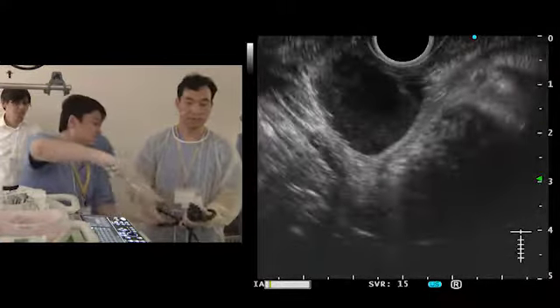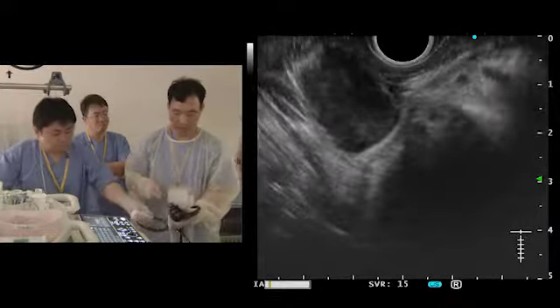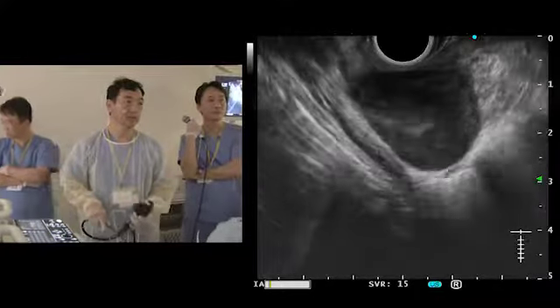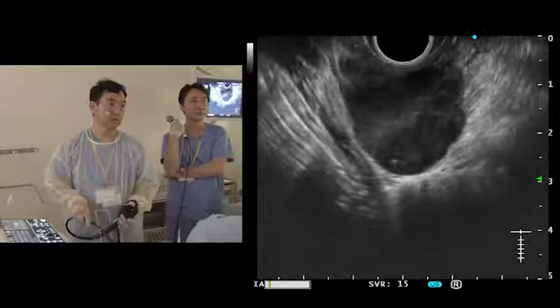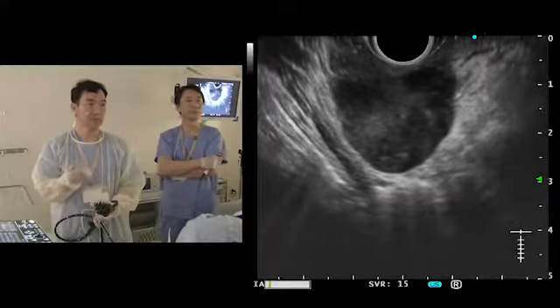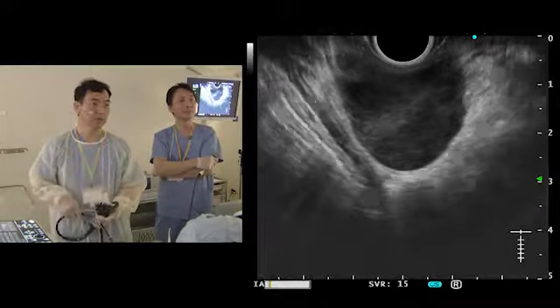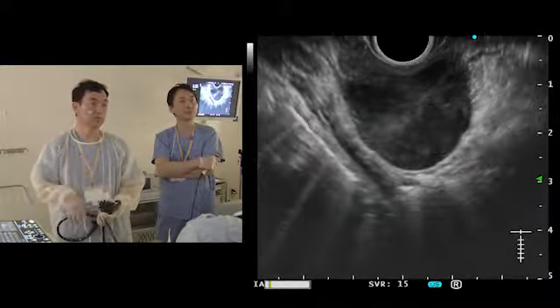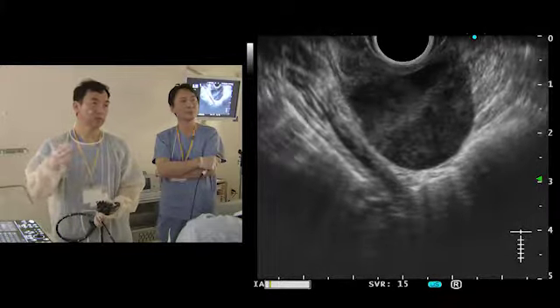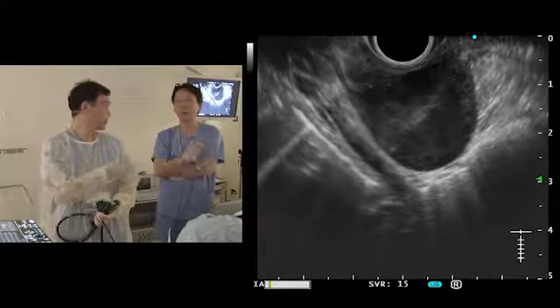Well, that's one biopsy. Now my strategy is to look at the first specimen and see how bloody it is, what the quality of the sampling is, and make sure that you don't see excessive bleeding. Then if there's not much tissue, not much blood, we move on to the suction method. For this type of solid tumor, we can do 10 to 20 cc suction, and then do the to-and-fro motion again, usually 10 to 20 times. Do you agree? Any comments?